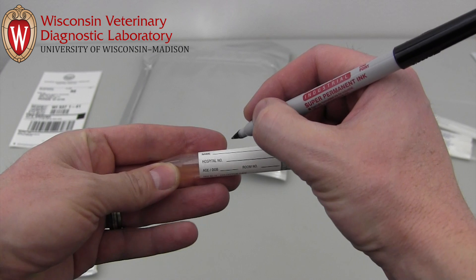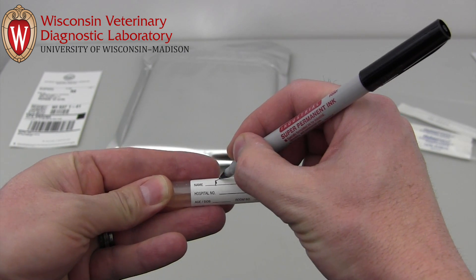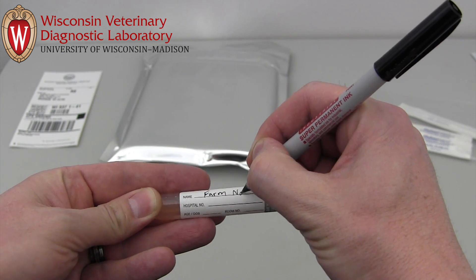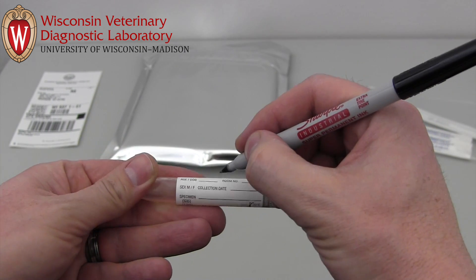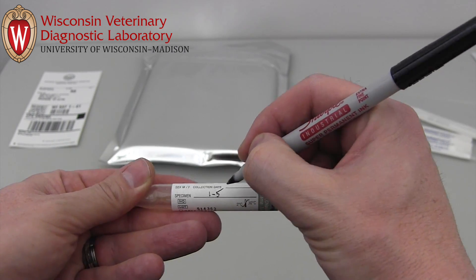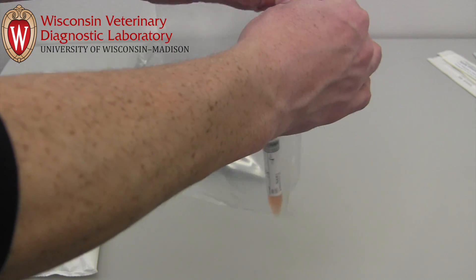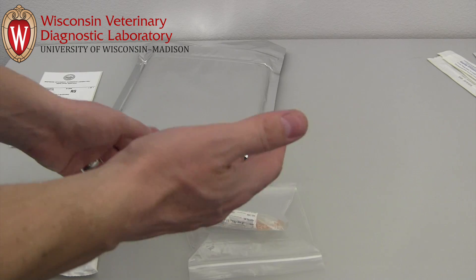The tube should be labeled to identify it in a way that matches the submission form. Once inoculated, the tube should be refrigerated or immediately shipped to WVDL with the provided ice pack. It is best if samples arrive at our lab within one to two days of inoculation. Place the securely sealed tube in the plastic bag. The insulated shipping envelope will hold the tube, the ice pack, and don't forget your completed submission form.